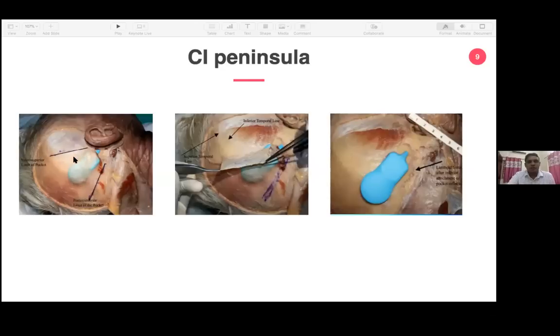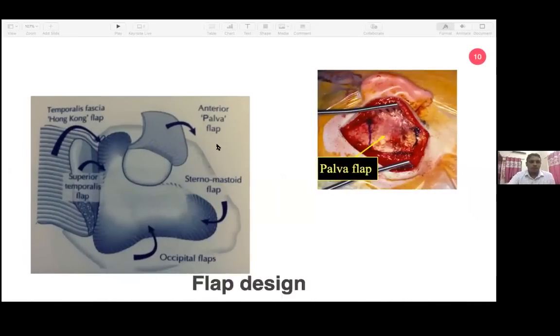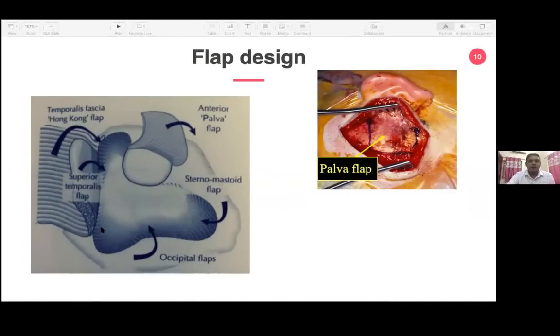So if one opens this layer at the suture line, there is no point in making a pocket here. So one has to make a tight pocket in between these two suture lines. So one has to elevate the subperiosteal plane only in between these two suture lines. So that is the idea of making a T-pocket technique. Suppose one has to go for a bed, you can make it in the Asterion or even in this region as per the scalp. Okay.